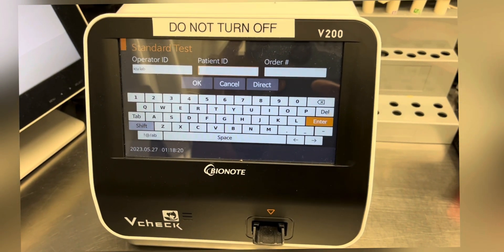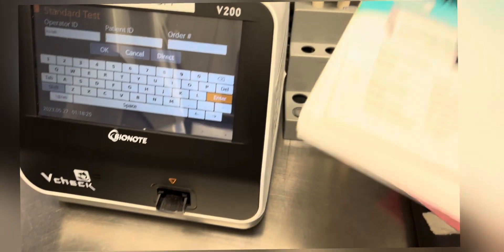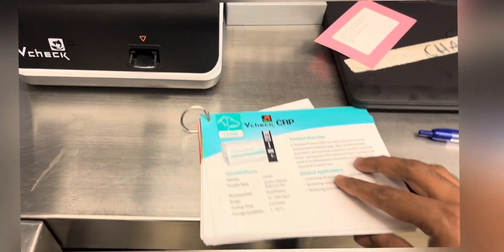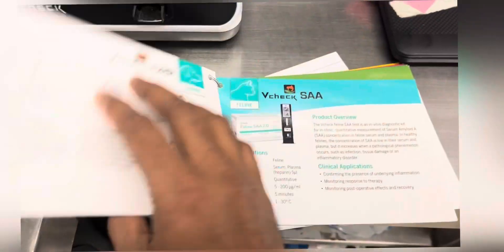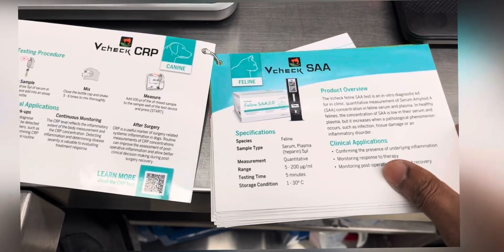The basic test procedure for all the tests is mostly the same, but there can be small differences in the quantity, the type of sample, or the different incubation time. So it is always good to see the QCO reference guide provided with the machine.